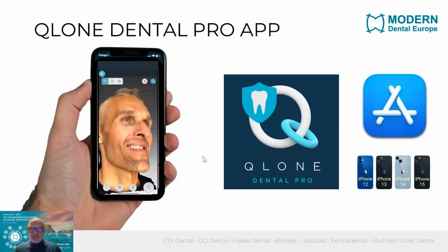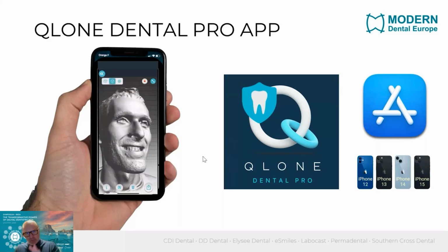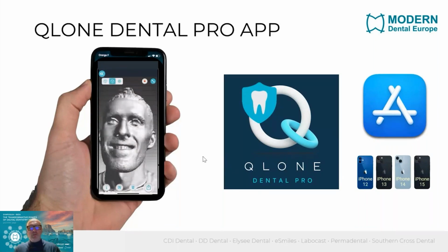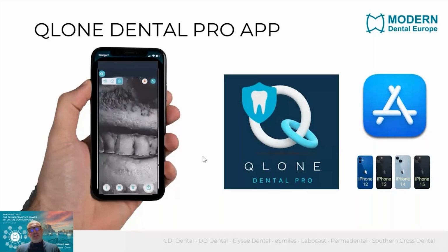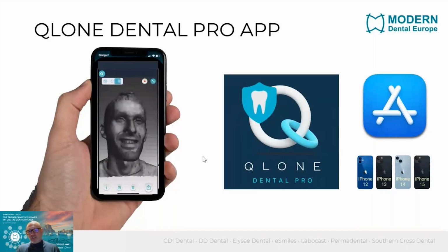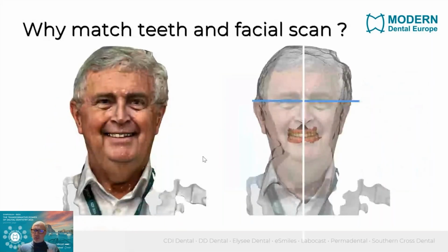It's very easy. It's only 20-30 seconds of scanning around the face, and then you zoom in on the oral zone, and you see that the mesh is actually quite detailed here. It's very comparable to Rayface, which is amazing, and they did an amazing job in quality if you see these results.